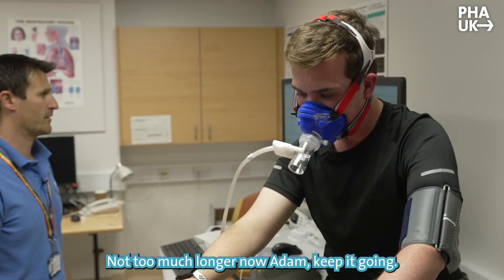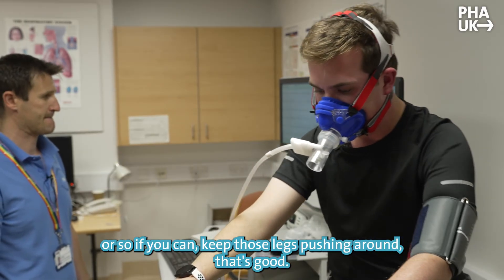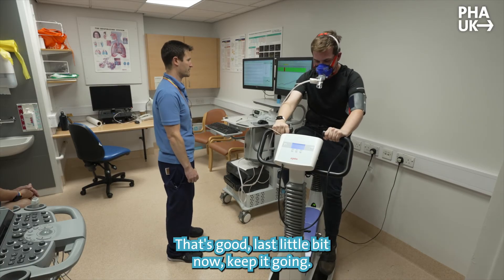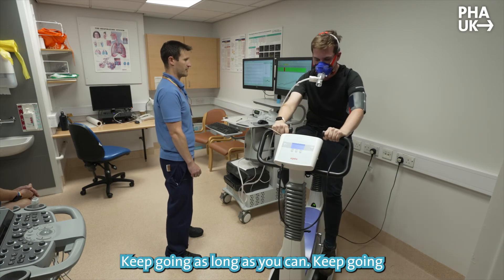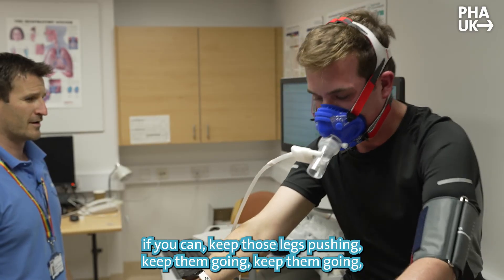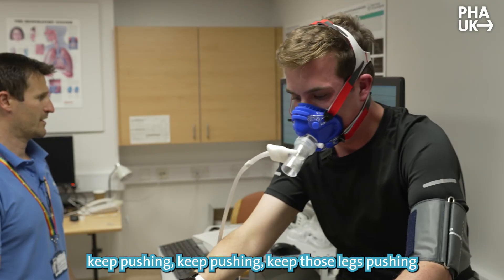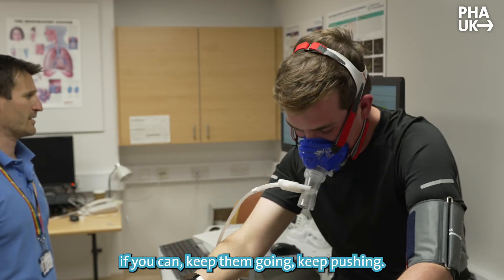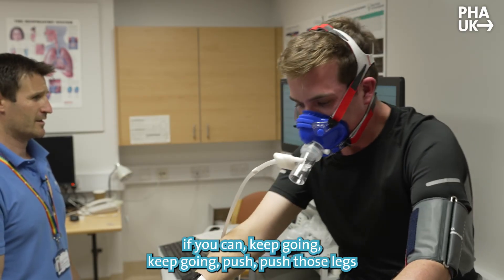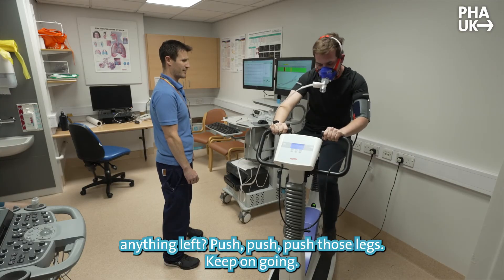Not too much longer now Adam, keep it going — last few minutes or so if you can. Keep those legs pushing around. Keep it going, keep going as long as you can. Keep pushing, keep those legs pushing if you can. Anything left? Keep those legs going, push those legs if you can. Last little bit — anything left? Push, push, push those legs.